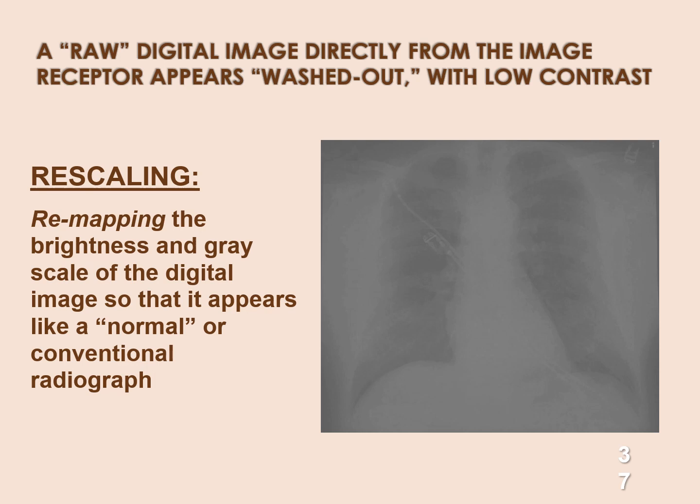And one of the first things it does is check whether the intensity values are in the expected range. In the software, they actually have saved intensity files that they match up with yours in order to judge whether you're overexposed or not. Okay? It's called a reference histogram.